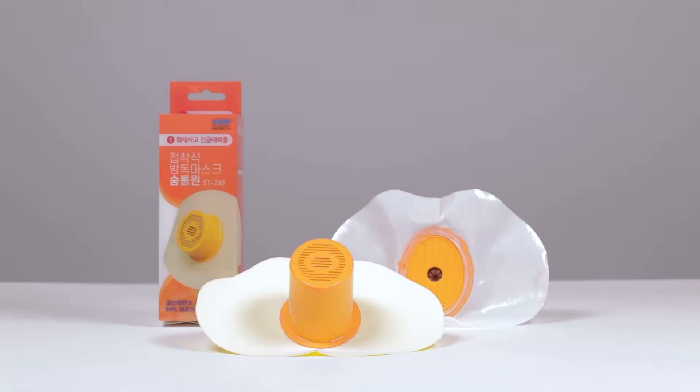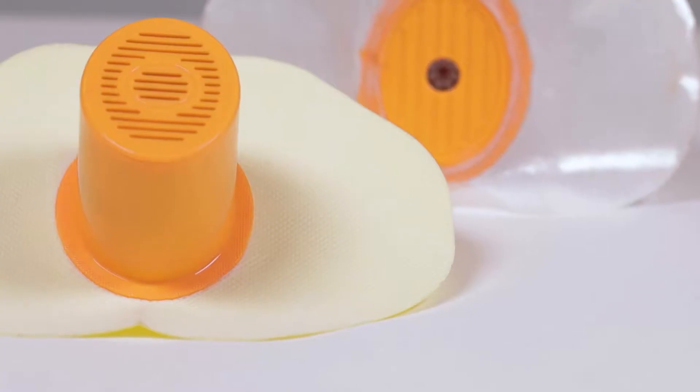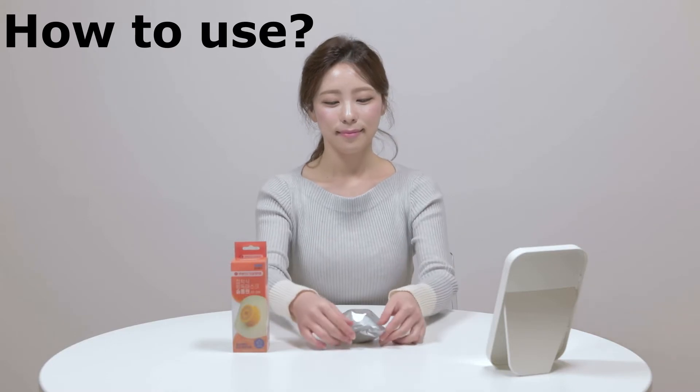YGF is a venture company with 16 outstanding intellectual property rights. Here is how to use this gas mask.